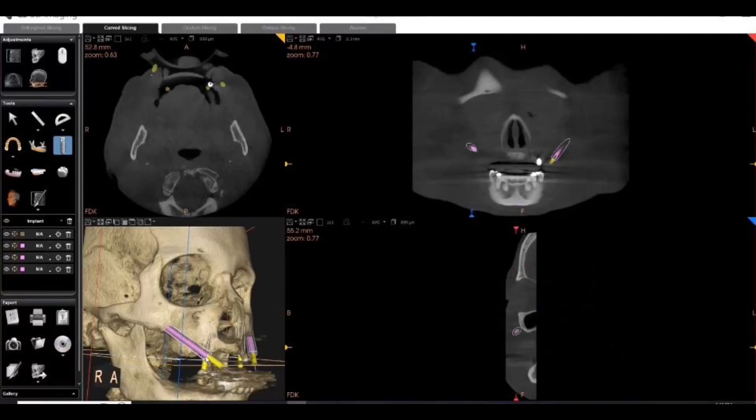Hey everybody, what's going on? So a couple surgeons reached out to me recently because they wanted to know a little bit more about planning implants in the Zygoma using the CareStream software. I'm certainly not an expert in planning those types of implants, but I can at least help them with the software manipulation. So that's what we did.